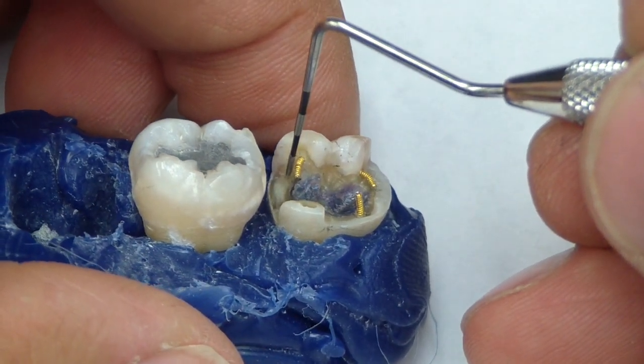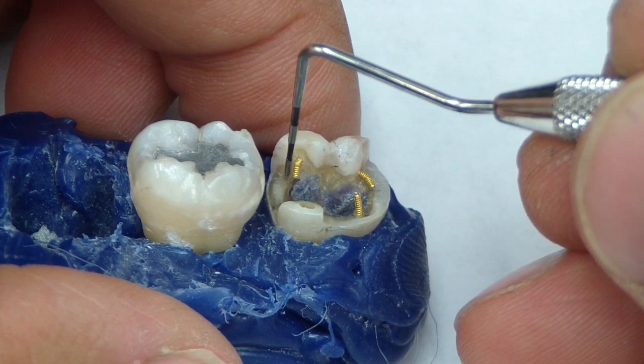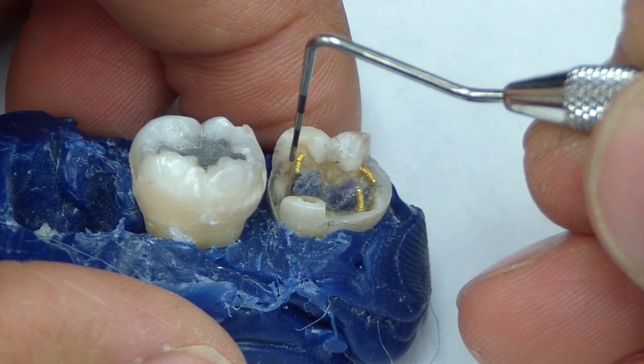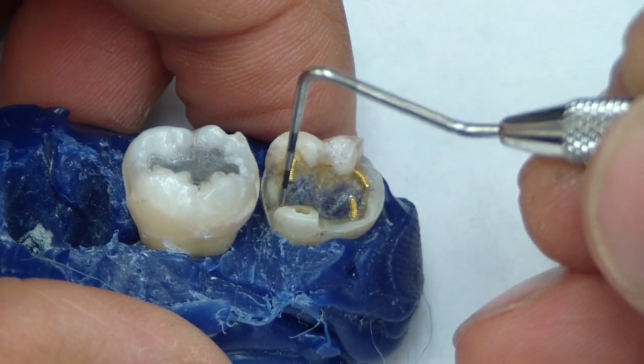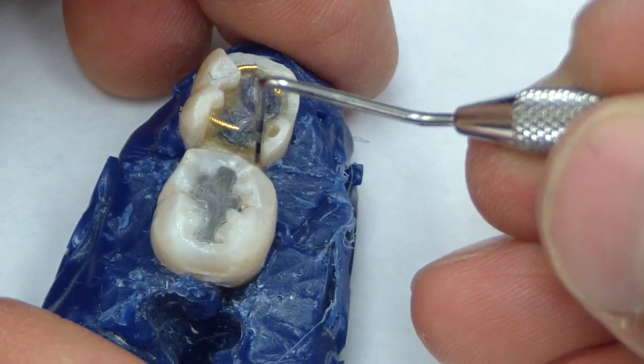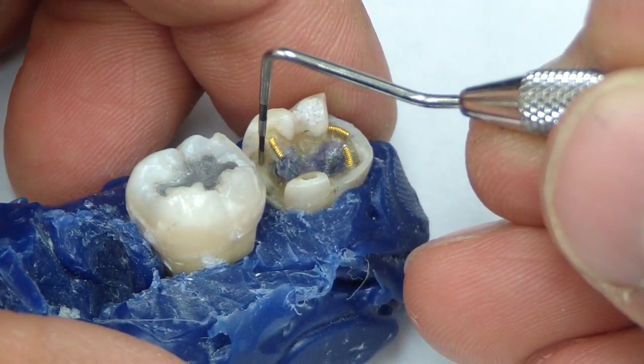I've placed some slots like Dr. K mentioned — just taking a 169 or 699 bur, about 0.5 millimeters in depth into the dentin and then slowly feathering coronally, just to place a little dovetail in there. Similarly, I place one here, very subtle. You should be able to take your probe and place it in there and have a little click.